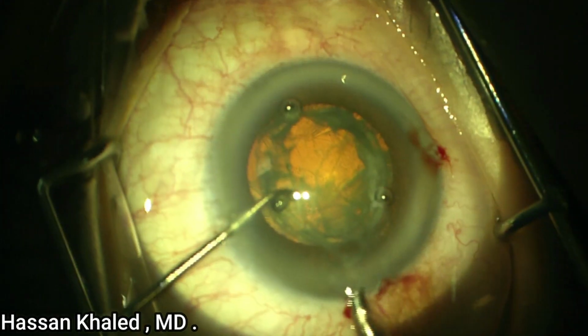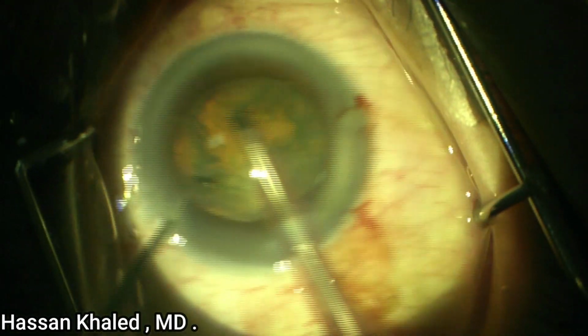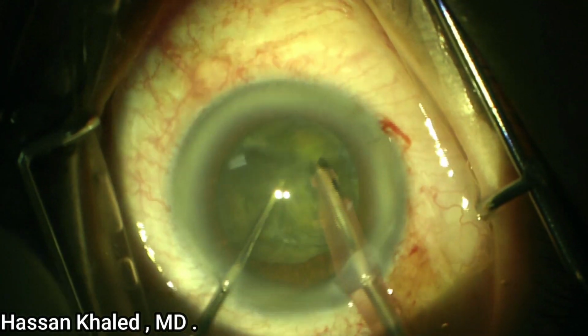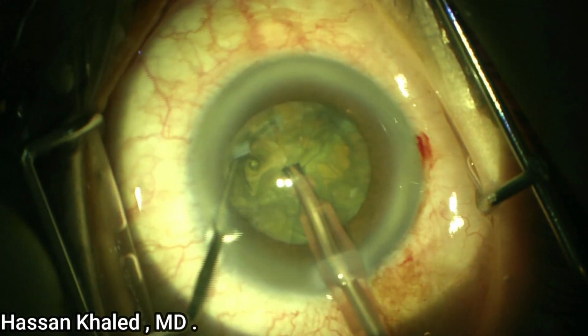Here I'm going to do horizontal chop technique, and the chopper should be a blunt tipped chopper. You can embed the phaco tip in the nucleus, go by the chopper underneath the peripheral cortex to the equator. You can see a complete separation.